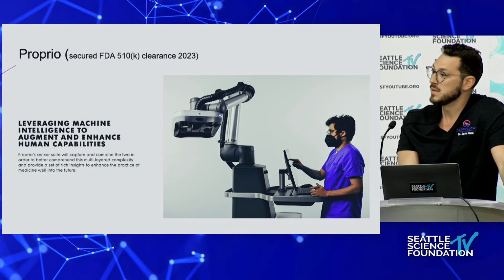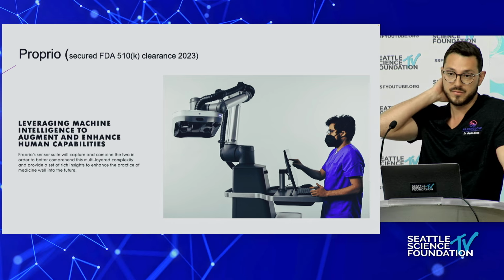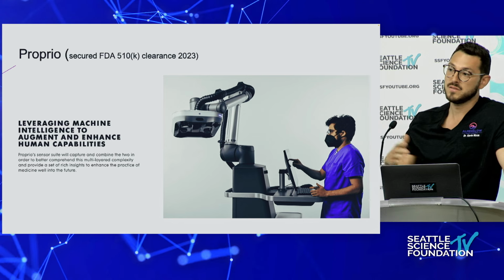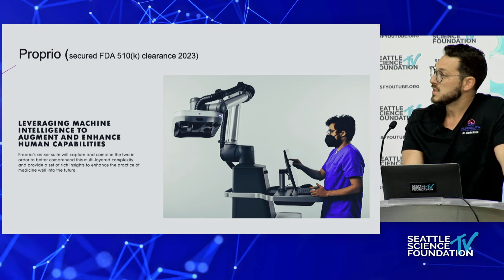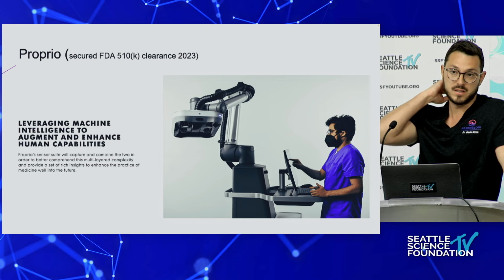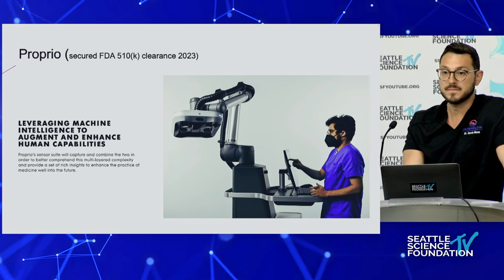It's a little bit tricky because a needle can bend through skin, and you're always going to have to confirm with fluoro, but it just means, can we take maybe 50% less pictures, 75% less pictures, and achieve these procedures in a faster, safer way using some of this technology that's coming aboard. So it's kind of open for research for anyone. You can reach out to these companies and see what can be done. But that is all I have for you guys.